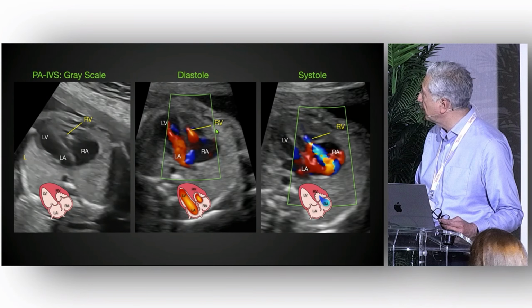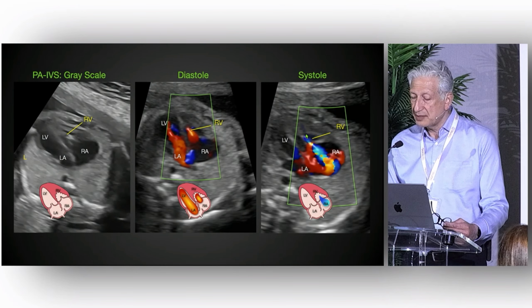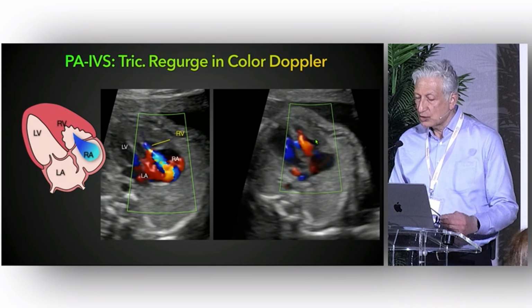Tricuspid valve, you see the filling, but you see also the severe tricuspid regurgitation as shown here.